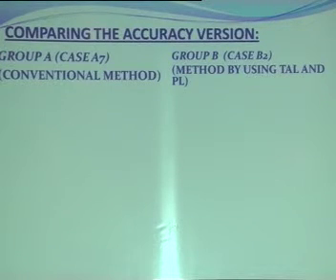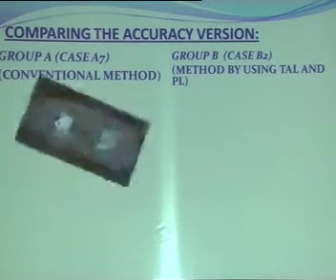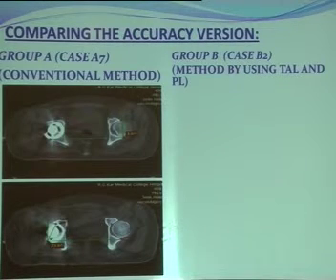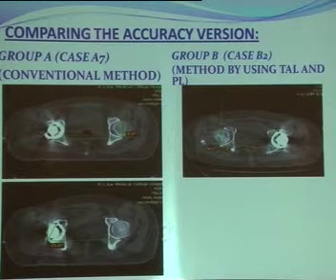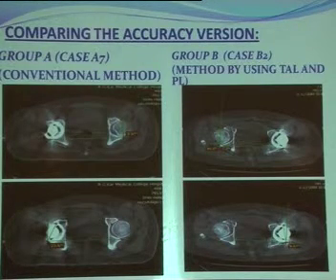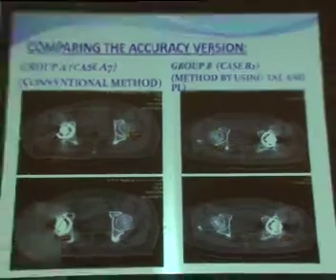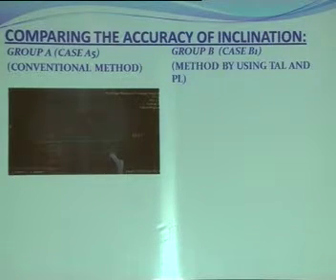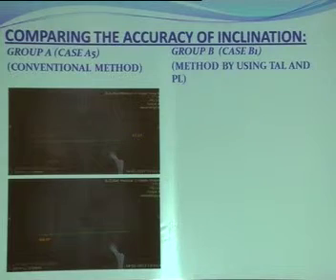Now to compare the accuracy between these two techniques, we put up two cases. In the conventional method, the preoperative version was 3.9 degrees and postoperatively it was 23.6 degrees, so the difference was 19.7 degrees. In group B, our method, the preoperative version was 7.2 degrees and the postoperative version was 9.6 degrees, so the difference was 2.4 degrees. Similarly, in case of inclination, in the conventional method, the preoperative inclination was 32.1 degrees and postoperatively it was 60.9 degrees, so the difference was 28.8 degrees.